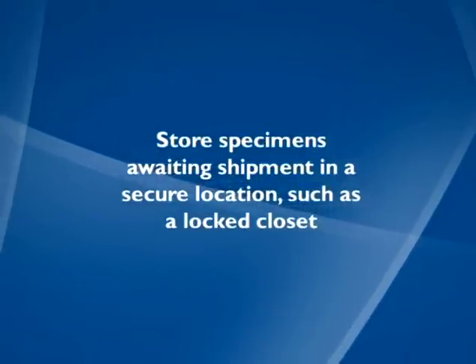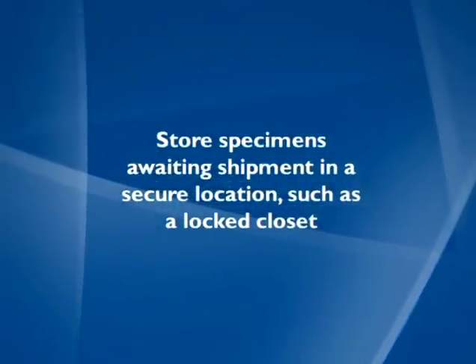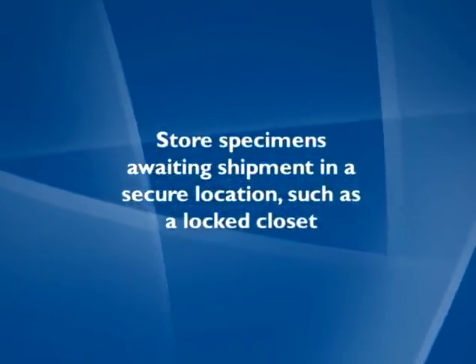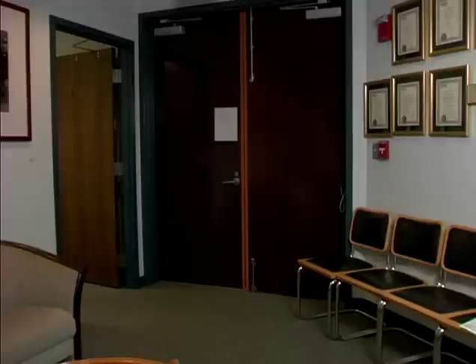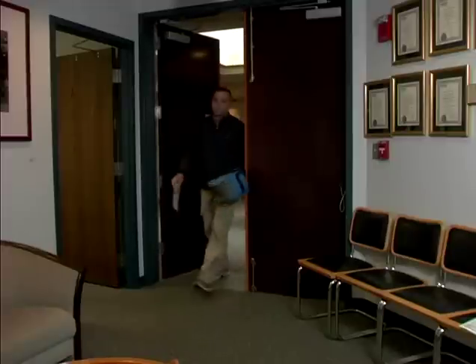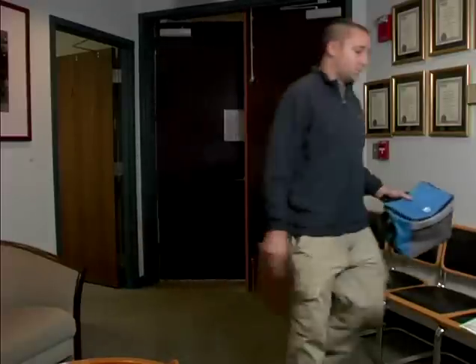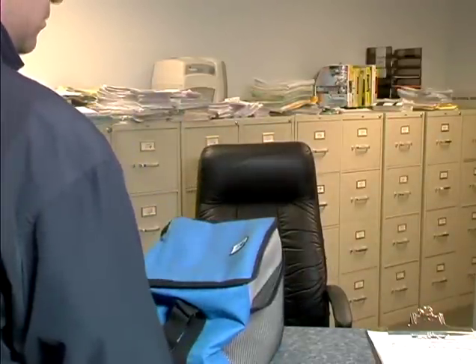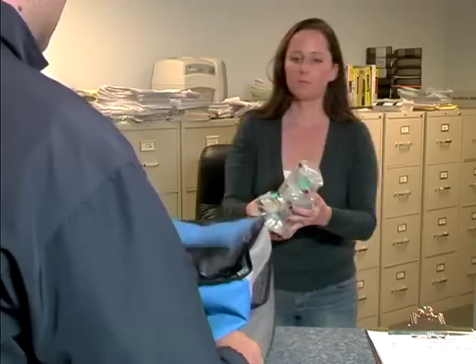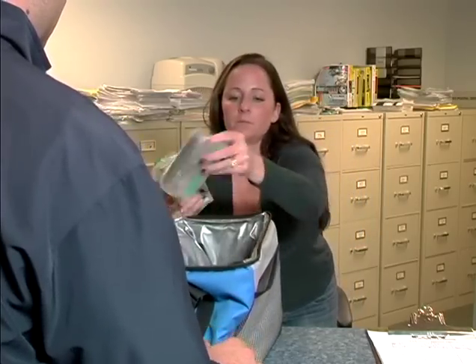In either case, proper packaging is necessary to ensure that the specimen bottles are not damaged while en route to the laboratory. Should there be some leakage, testing can still be conducted. However, excessive leakage may result in a canceled test and may require you to complete error correction training. More information on this and other collection flaws will be discussed in Part 10, Collection Flaws, and Part 11, How to Correct Common Collection Errors.